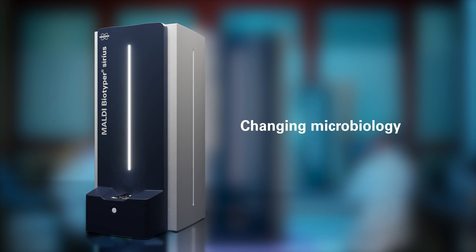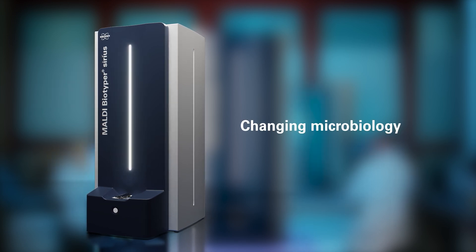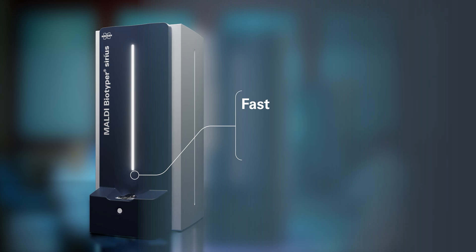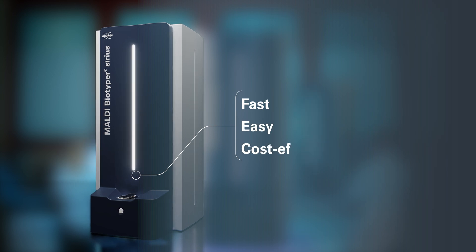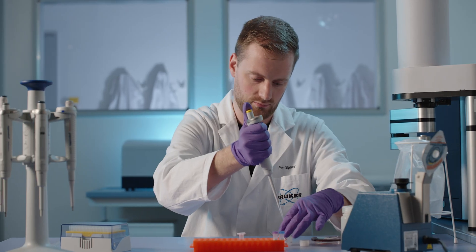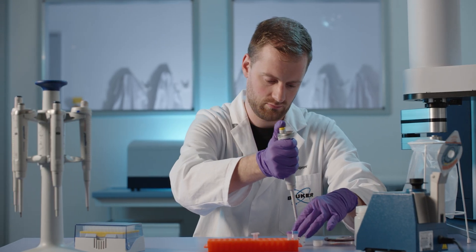For over a decade, Bruker has been changing microbiology through the application of MALDI-TOF as a fast, easy and cost-effective method for microbial identification.